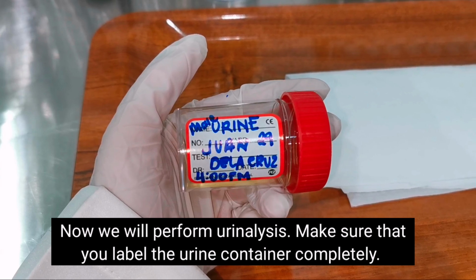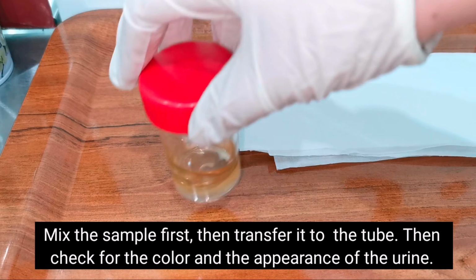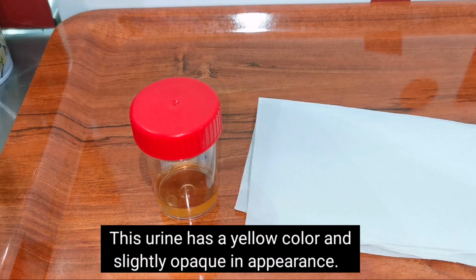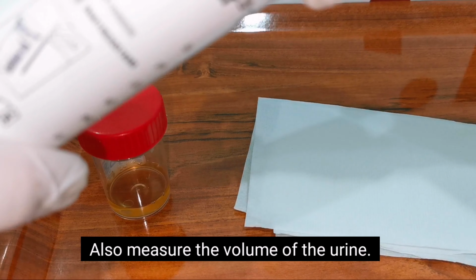Make sure that you label the urine container completely. Mix the sample first, then transfer it to the tube. Then check for the color and the appearance of the urine. This urine has a yellow color and is slightly opaque in appearance. Also measure the volume of the urine.